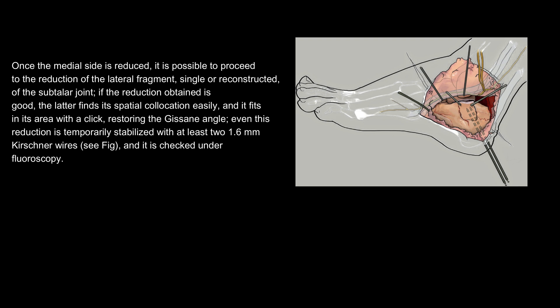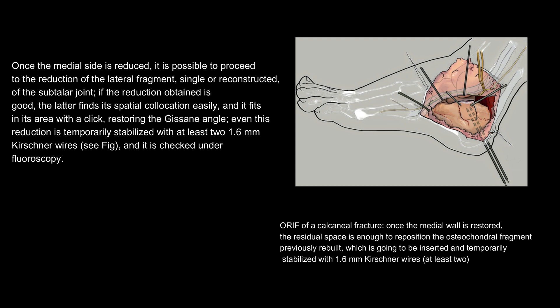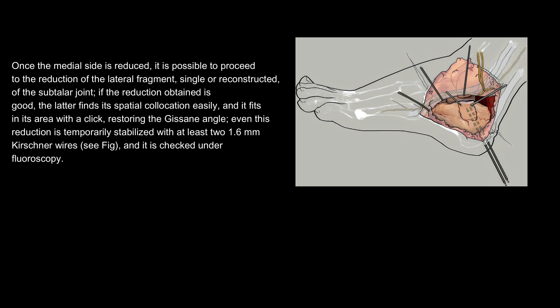This reduction is temporarily stabilized with at least two 1.6 mm Kirschner wires and checked under fluoroscopy. ORIF of a calcaneal fracture: once the medial wall is restored, the residual space is enough to reposition the osteochondral fragment previously rebuilt, which is inserted and temporarily stabilized with at least two 1.6 mm Kirschner wires.